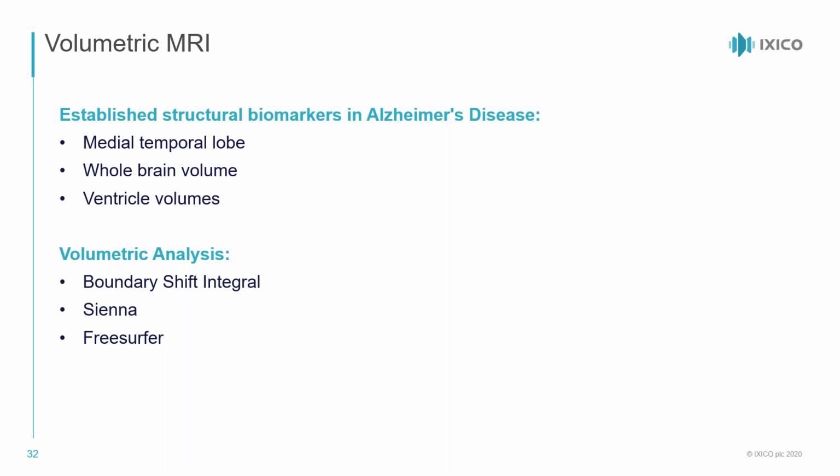These methods have demonstrated good sensitivity, accuracy, and reproducibility, but may not necessarily have the flexibility to adapt well to new regions of interest, and can sometimes require manual intervention in order to achieve optimal results. And this may take the form of semi-automated initialization, parameter tuning, or post-processing and segmentation refinements.